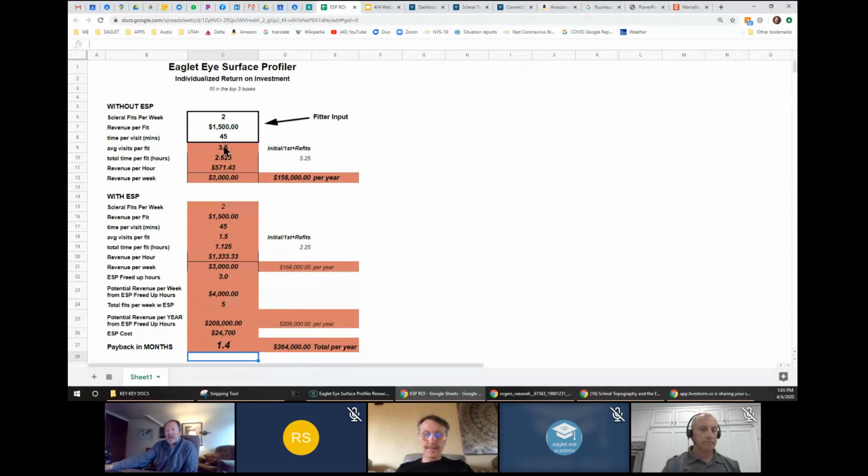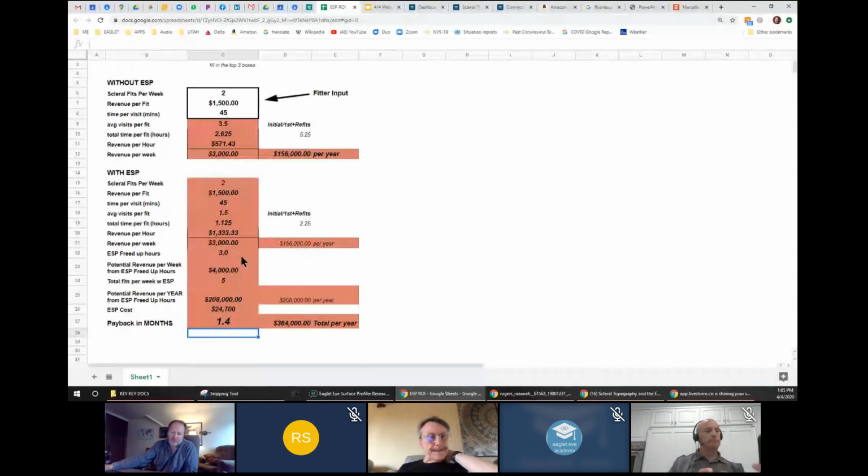So if you jump from 3.5 lenses per eye down to 1.5, you're still going to generate $3,000 from those 2 fits, but the time savings is going to be substantial. In this example, we're going to free up 3 hours per week, which is potentially going to generate $4,000 for you in more patient volume.